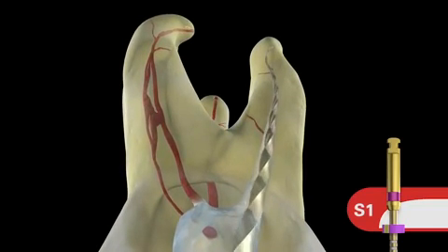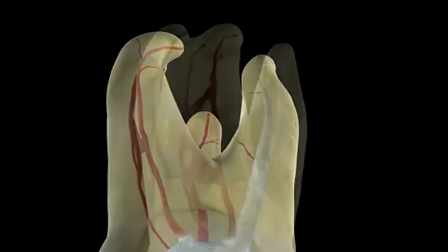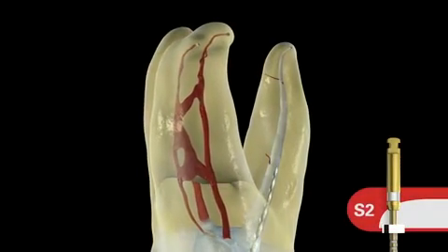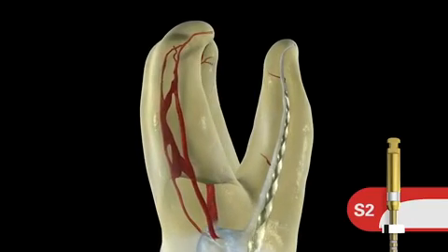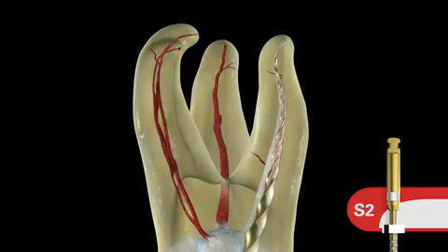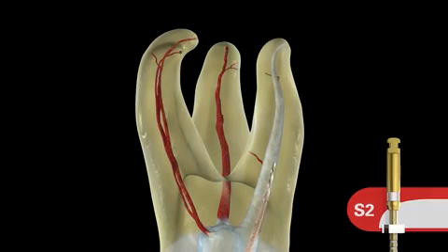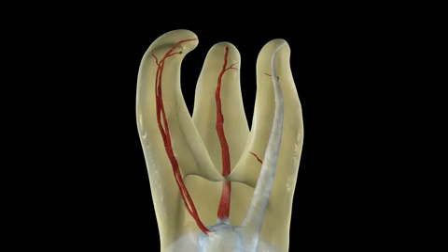I can't overemphasize brushing. I say brushing around the world, and you all nod your heads and say yes, yes. But brushing is deliberate, it's intentional, and it's purposeful, and it's done on the outer wall on the outstroke. Brushing makes lateral space and allows the bigger Eiffel Towers on S2 to reach length. The Shaper 1 and the Shaper 2 now have projected and carried a shaping wave ever deeper into the curvature. We're now ready to talk about finishing the apical one-third.